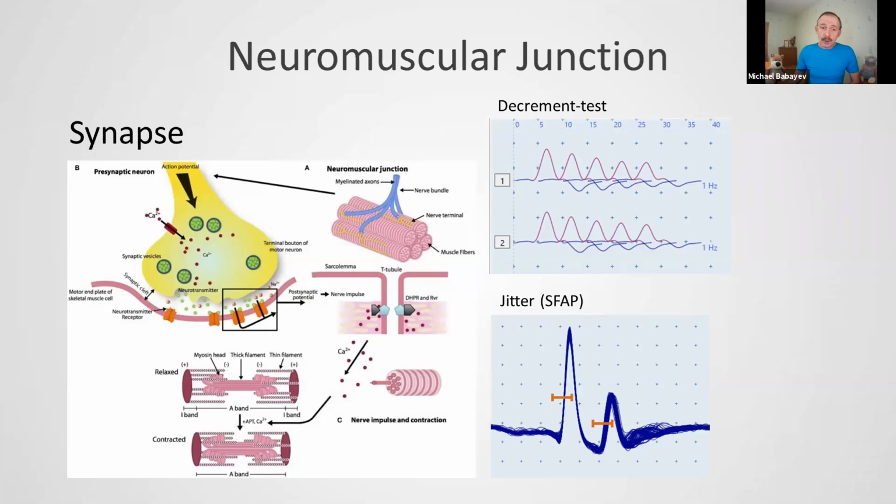How can we record this signal? We put a small needle into the muscle near two neighbor muscle fibers from the same motor unit. And we ask a patient to make a small muscle contraction. Our brain sends activating signals. This motor unit will be activated with some rate, and we can record some signals, action potentials.